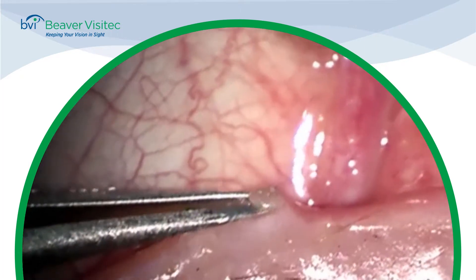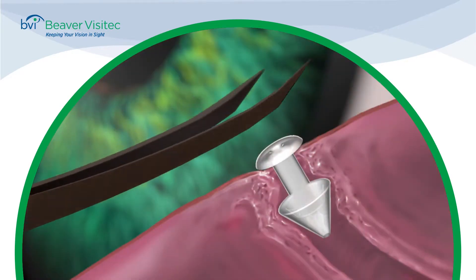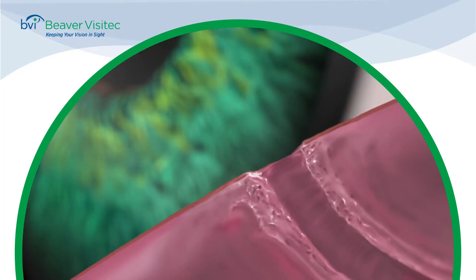Though intended for permanent placement, the Parasol can be easily removed with forceps. Simply grasp under the dome and apply upward pressure. The shaft will stretch while the nose reverses for quick removal.